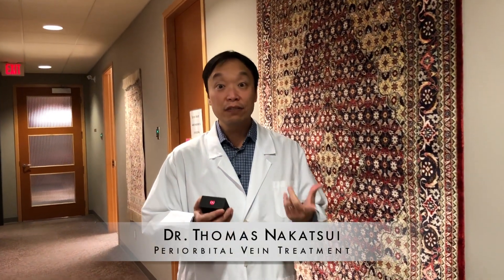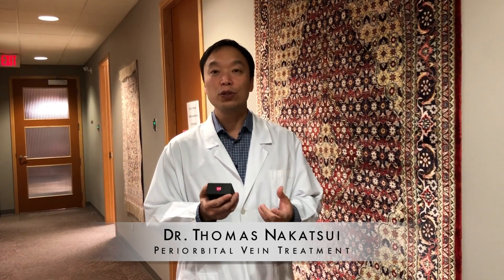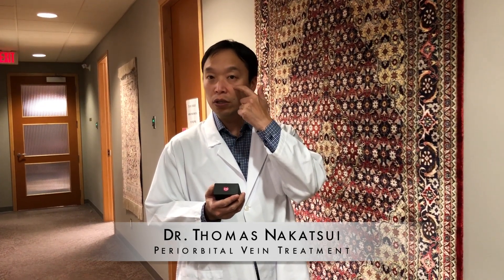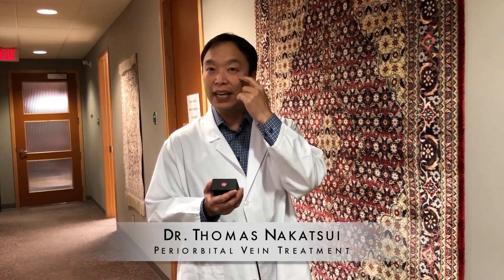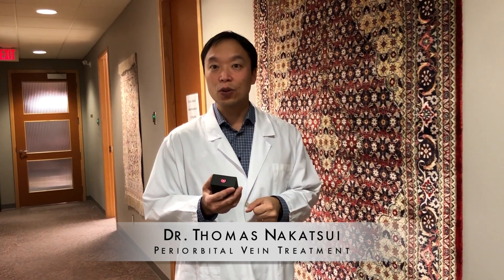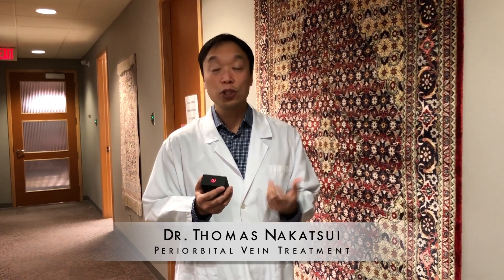Hi, this is Dr. Nakatsui. Today I just want to show a little video on what we do to treat the little periorbital veins that are around the eye. Some people have very obvious veins and they really don't like it, so what we're going to do is show a patient.